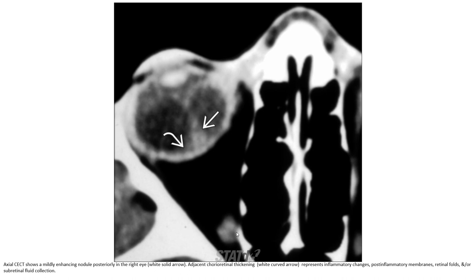Let's see the first case. This is the contrast-enhanced CT showing a small enhancing nodule in the right eye. Adjacent choroidal and retinal thickening represents inflammatory change. There is a post-inflammatory membrane at the retinal pole and subretinal involvement. These are the imaging findings in the case of ocular toxocariasis.